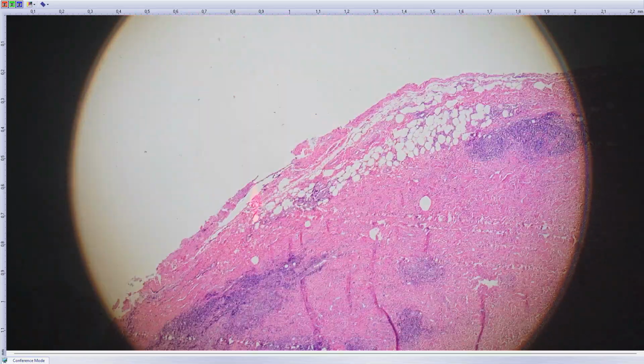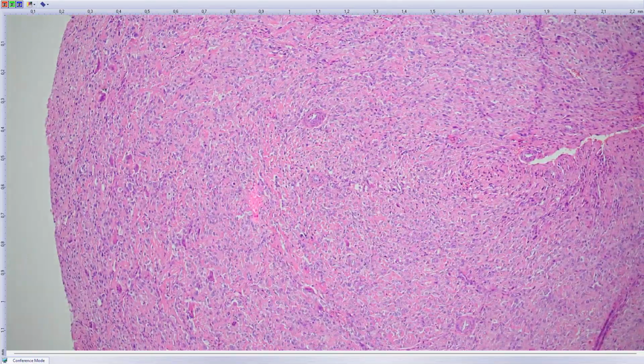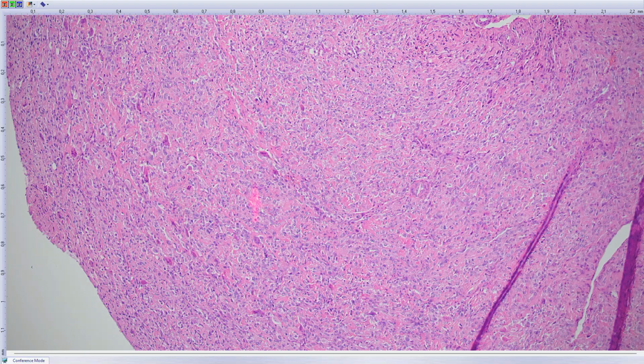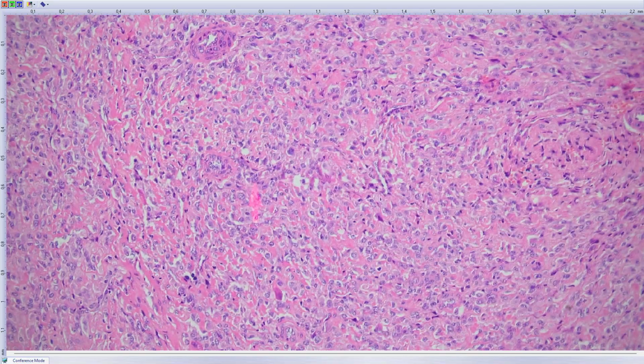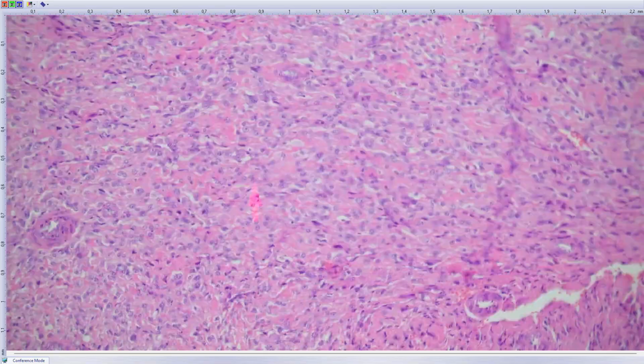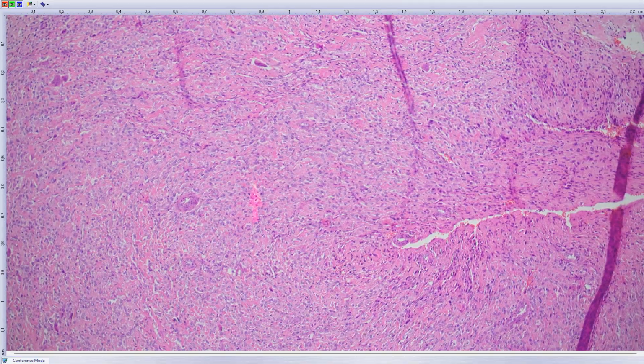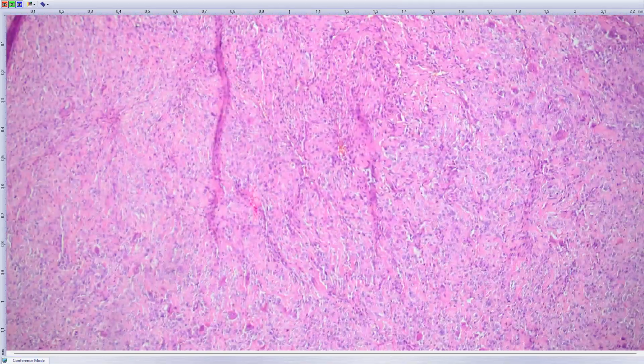It was sent as sarcoma, possibly malignant tenosynovial giant cell tumor, which I completely understand based on morphology, because we see here sclerotic stroma, epithelioid cells in between that, but the location is completely unusual. Malignant tenosynovial giant cell tumor would be most common in the knee or elbow or some other large joints, occasionally on the hands or feet, but not in the spermatic cord.